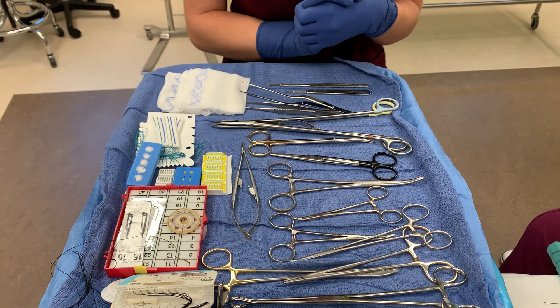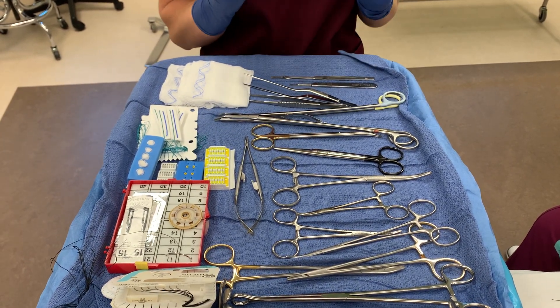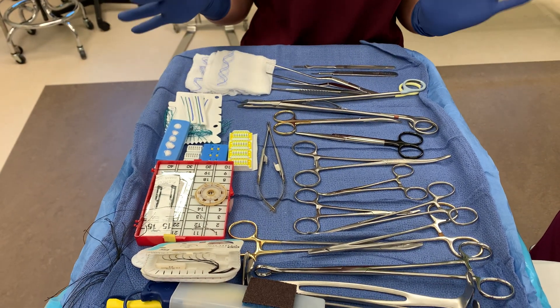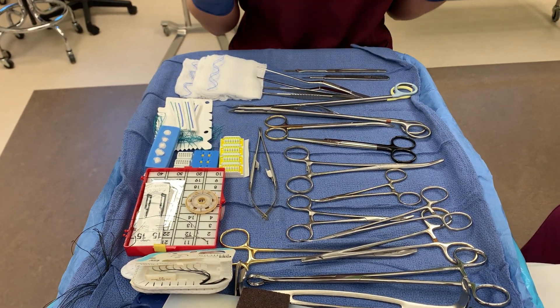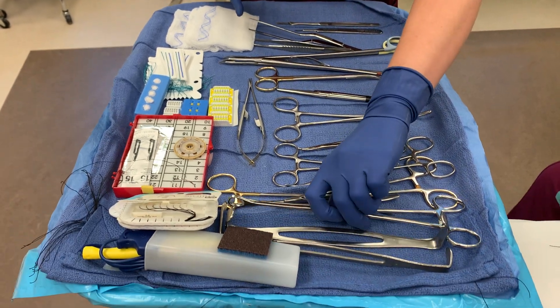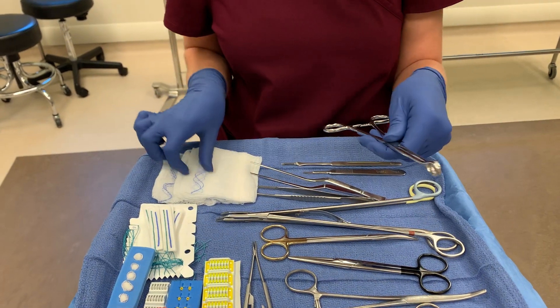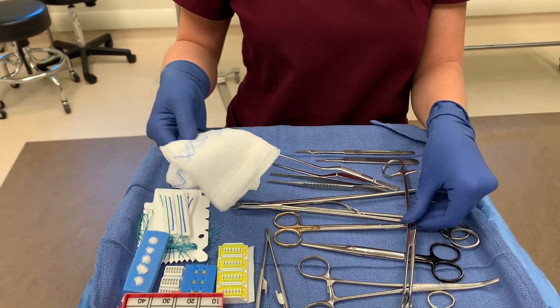This will be the advanced instrument technique video two. The first one we're going to go over is a sponge stick. You need to know what instrument is used to create a sponge stick. I'm going to get my ring forcep — this is just a ring forcep by itself — but I also need a Raytec to create this.